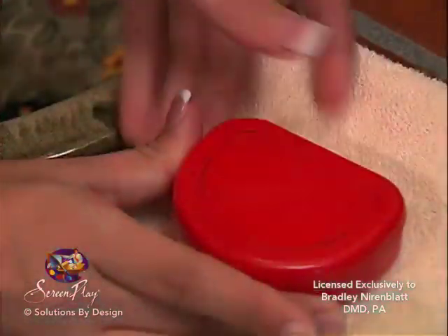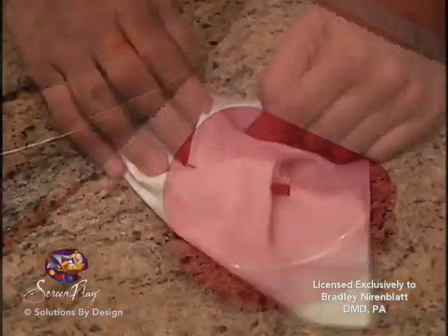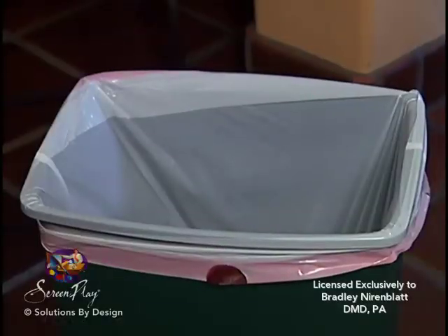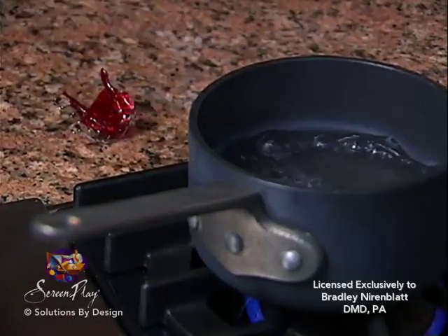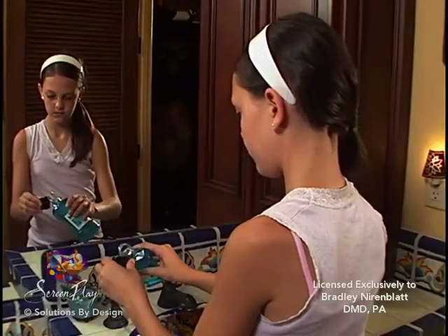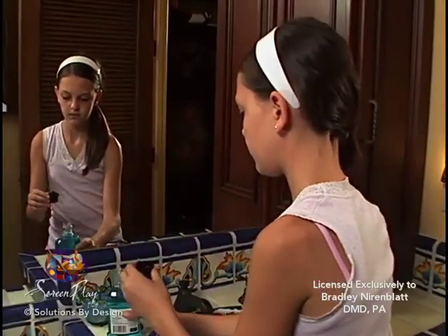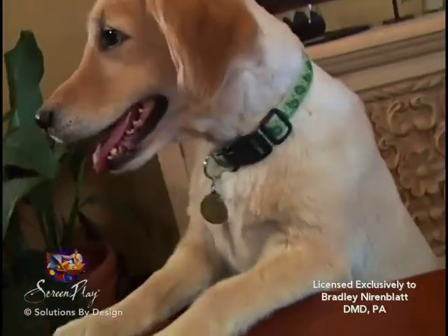Make sure you keep your twin block clean and in its case when you are not wearing it. Your twin block is fragile and expensive, so do not put it in your pocket or wrap it in a napkin. Do not put your appliance in hot water or near heat as the plastic will warp. Do not soak your plates in mouth rinses or disinfectants as this may affect the plastic and make them taste bad. Do not leave your appliance lying around where others or your family pet can get to it.